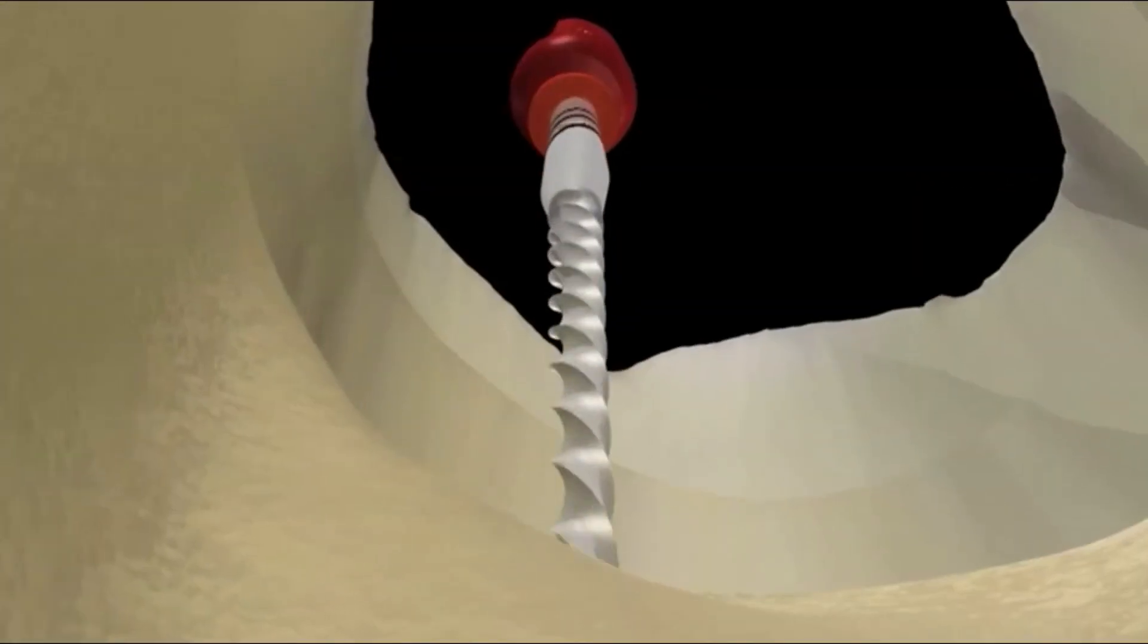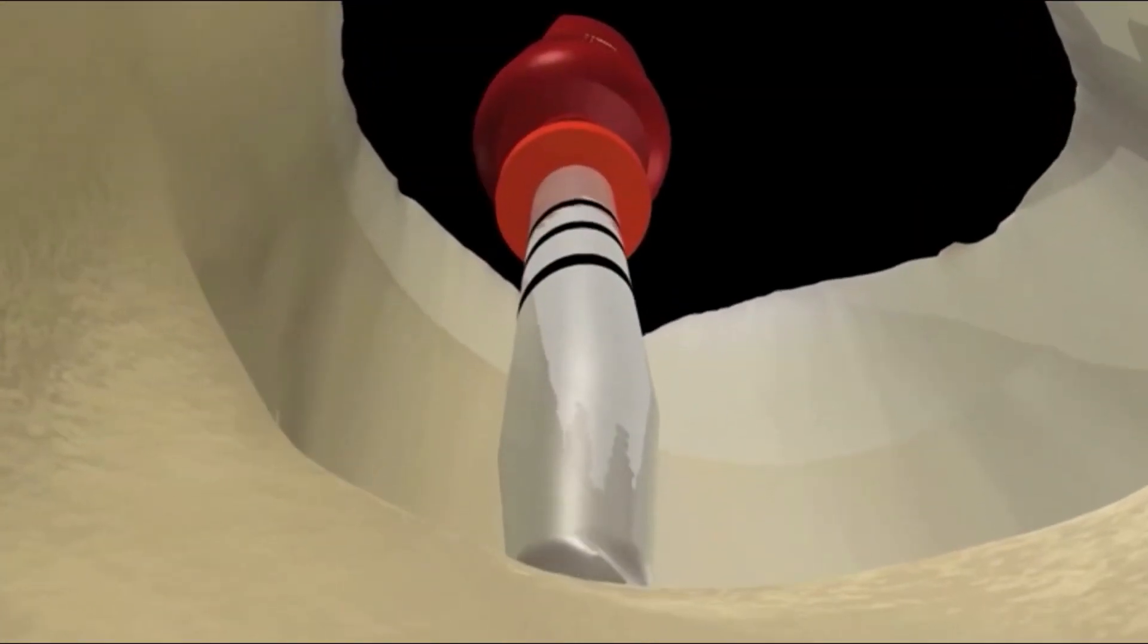Start by checking your final shape with a size verifier. It should fit passively at working length.